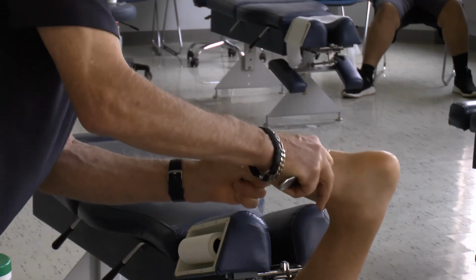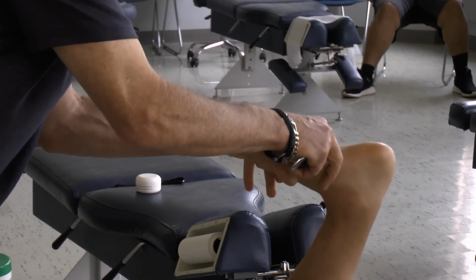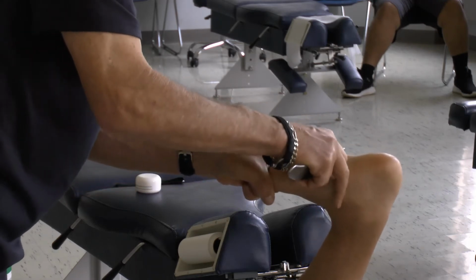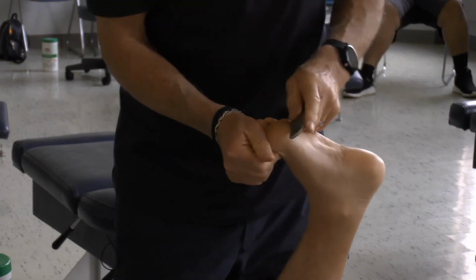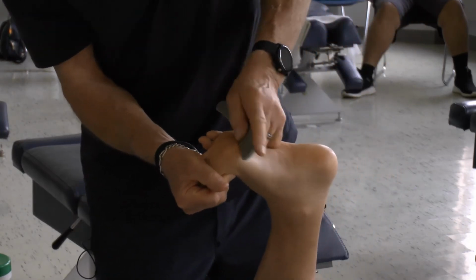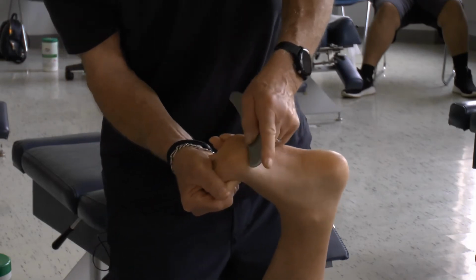And I want to come across the tissues as well. I'm holding the toes in a bit of dorsiflexion to put a stretch on that plantar fascia. Going to pay a little closer attention to the attachments at the big toe and just work that under a bit of a stretch.